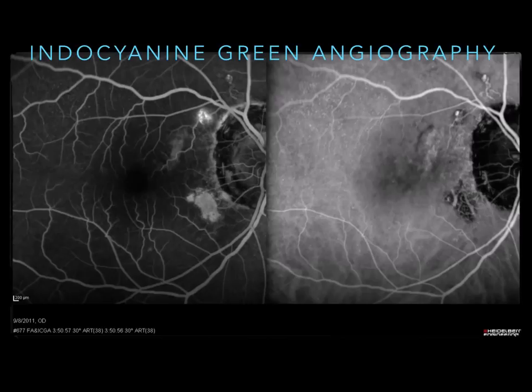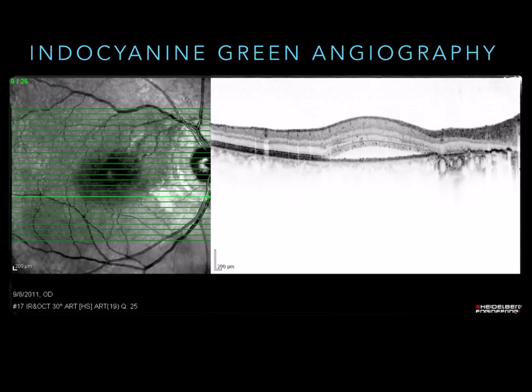You can see choroidal vessels past it, right there. And it's because the choriocapillaris is also killed off in that area. So the RPE is done, and that's why you get a window defect on the fluorescein on the left, but then you're also seeing the choroidal vessels through that. And then this is a patient with polypoidal choroidal vasculopathy. Again, I didn't have to use an arrowhead.